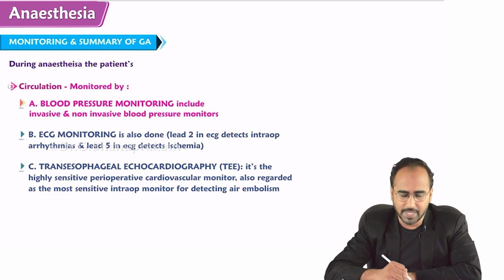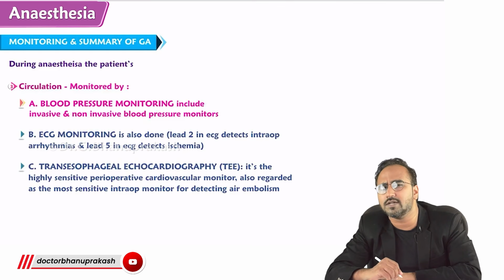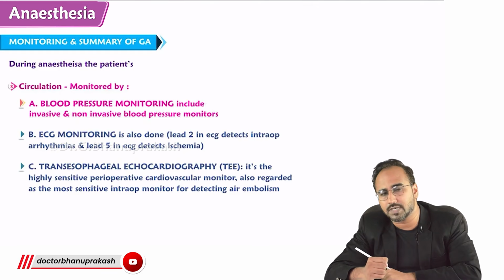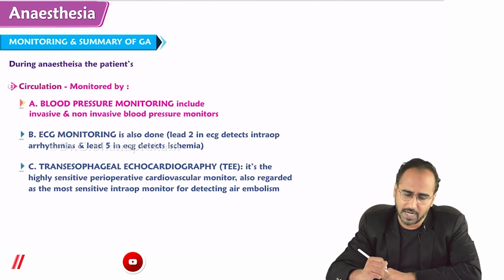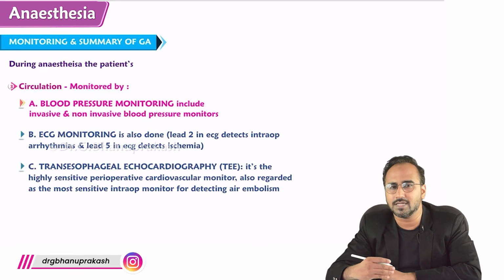Now you have to monitor the patient's circulation. How will you come to know the patient is being adequately circulated or not? Let me repeat this once again.